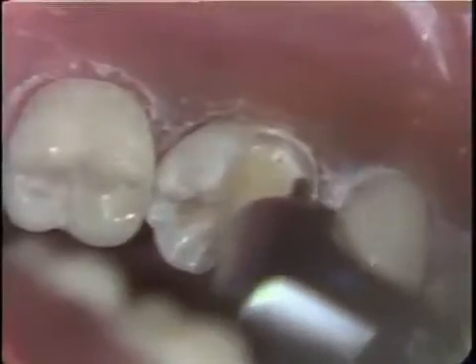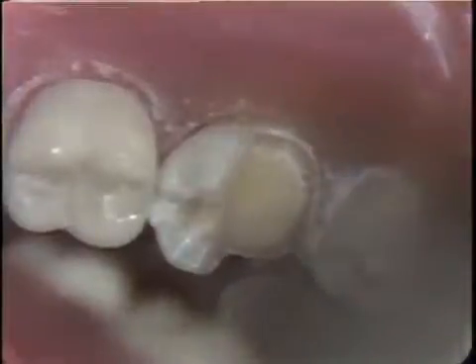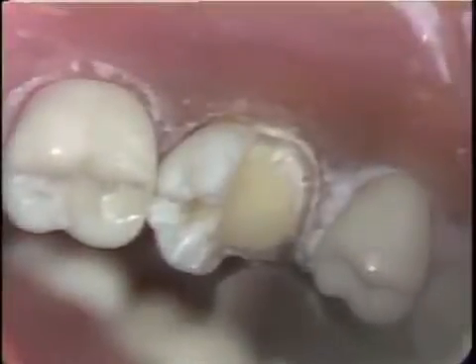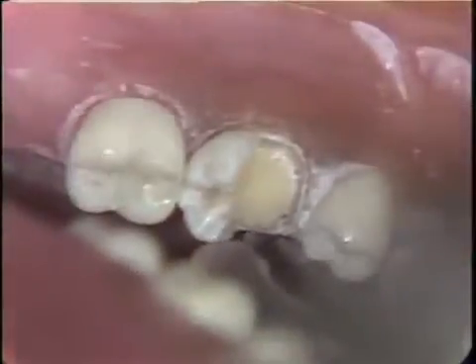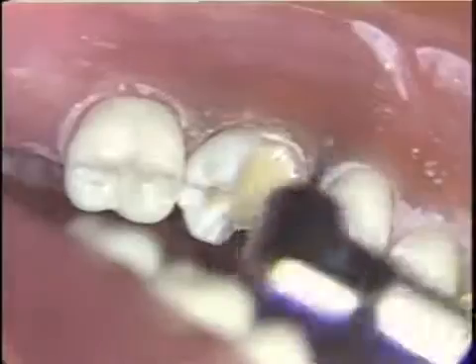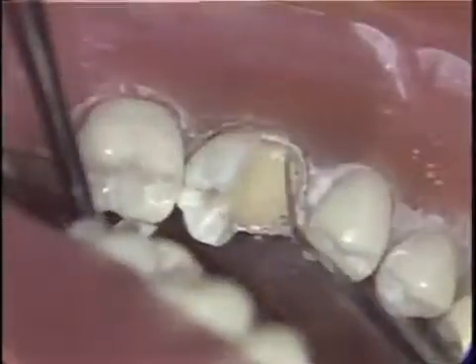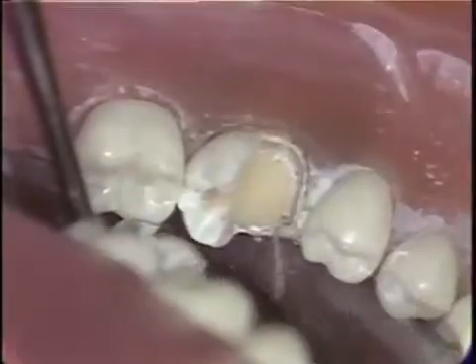Do not stop the twist drill in the tooth when drilling these pin holes, as there is a great chance of breaking the twist drill off in a pin hole, making it very difficult to remove. Each pin is placed at a slightly different angle to the long axis of the tooth, so there is no common line of draw and the amalgam is locked to the tooth. The depth of the pins are now checked using a pocket measuring probe — they should all be three millimeters in depth.